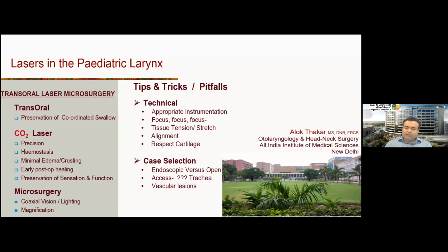So one of the things which changed that was the flexible fiber laser. I've been using flexible fiber laser for the past 7 years of my practice. We must have done close to 200 cases with laser. And it's a great tool in the pediatric airway. And the reason I say that, in the pediatric airway, you're essentially targeting a 4 or a 5 millimeter airway through a microscope from a distance.